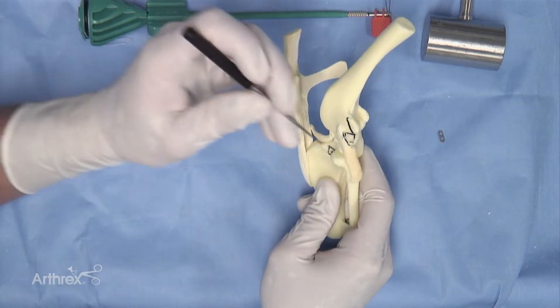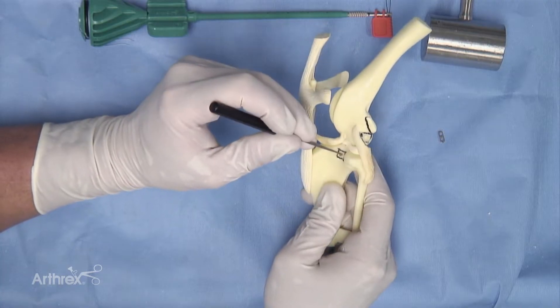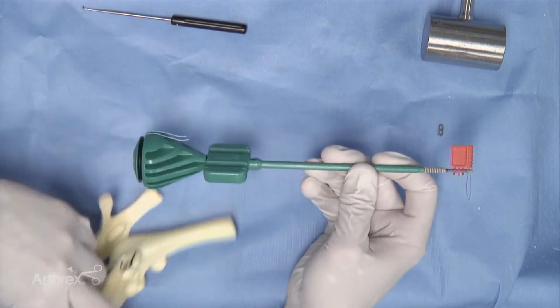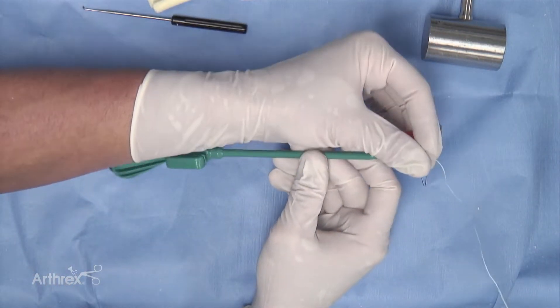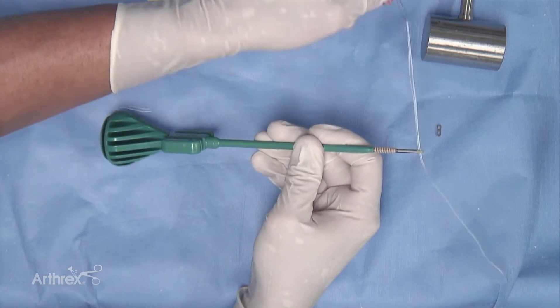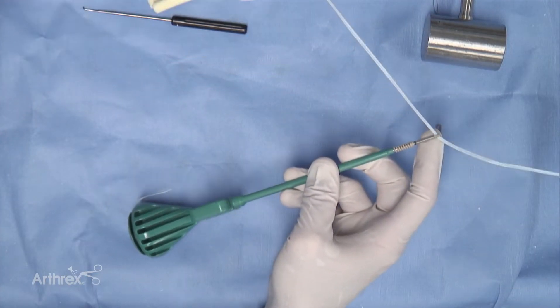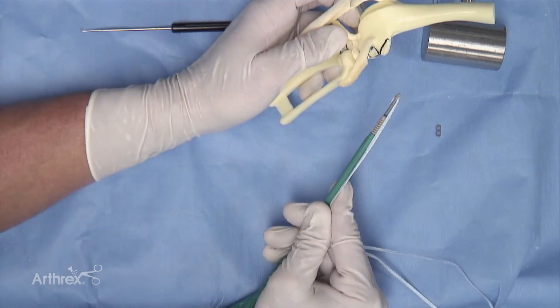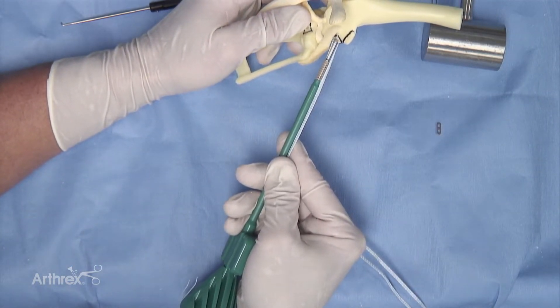In this model, which has been pre-prepared with the femoral socket and the tibial tunnel, we initially prepare the swivel lock implant by placing one end of the fiber tape strand through the eyelet of the swivel lock. The material is then pulled until we have an equal distribution of length of the fiber tape. This swivel lock is now loaded and can be placed into the femoral socket.